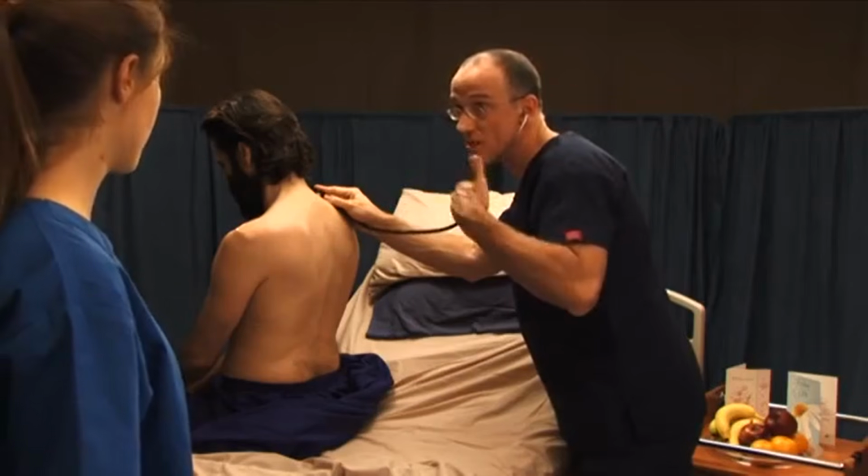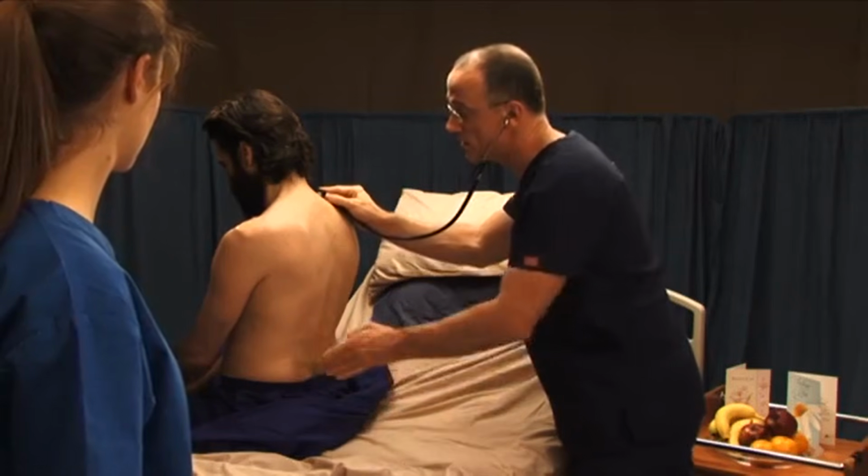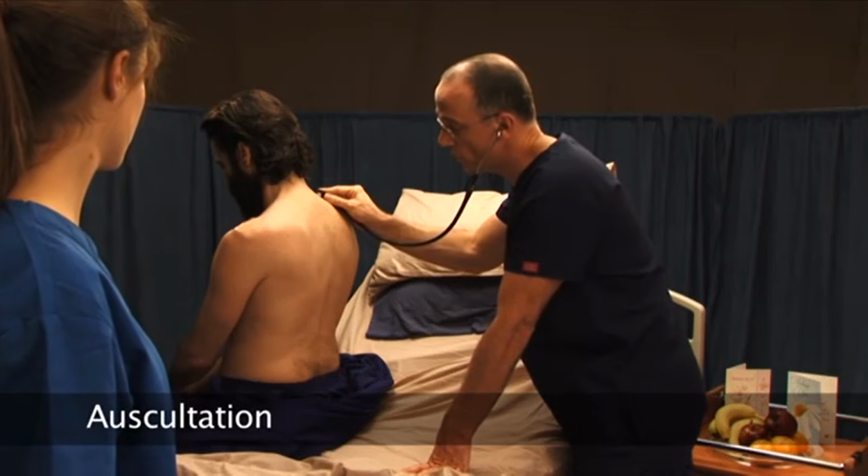The final step is to listen. You listen from side to side as you move down the chest wall. And open mouth, if you could just take some nice normal breaths, please.